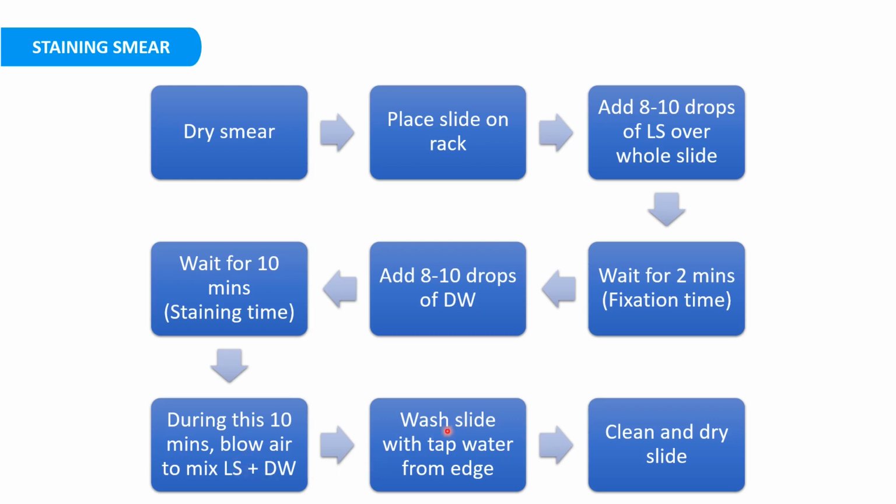Then after 10 minutes we have to wash the slide with the tap water from the edge, then clean the slide and then dry the slide. So these are the steps of staining the smear. Now let's watch the video of how to stain the smear.